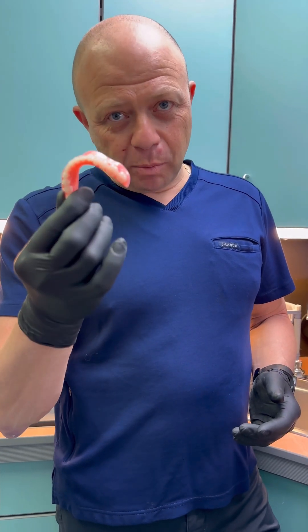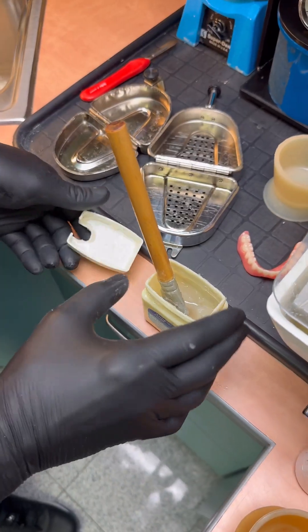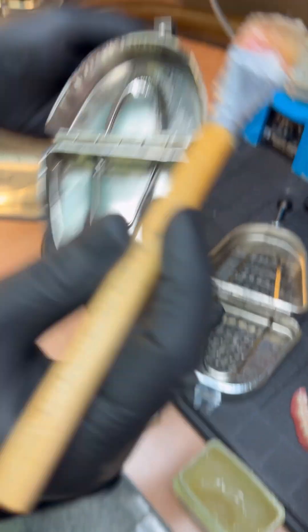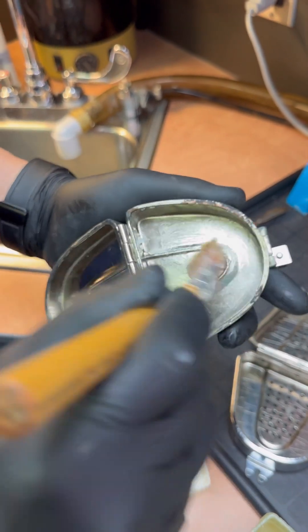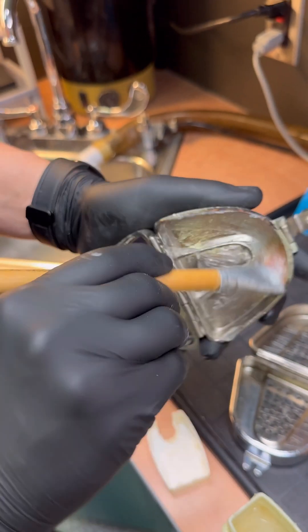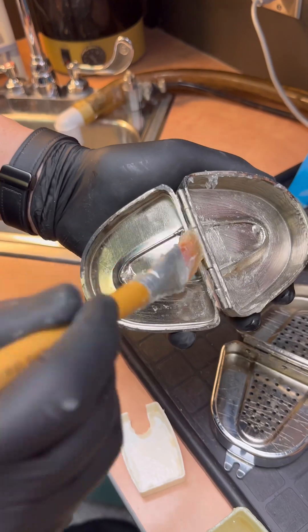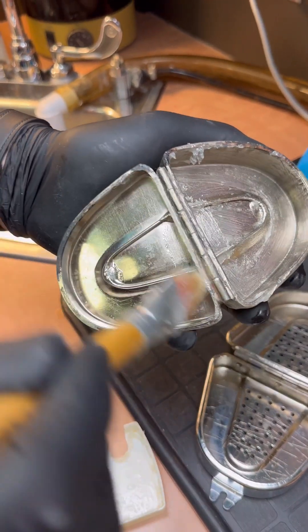The first thing we do is Vaseline the inside of the flask. Vaseline everywhere so you have a nice coat. Vaseline the joint especially, because once the acrylic gets in there, it will be a problem.